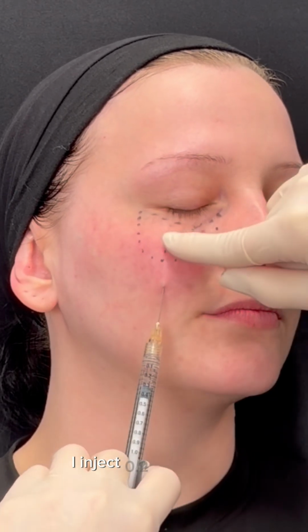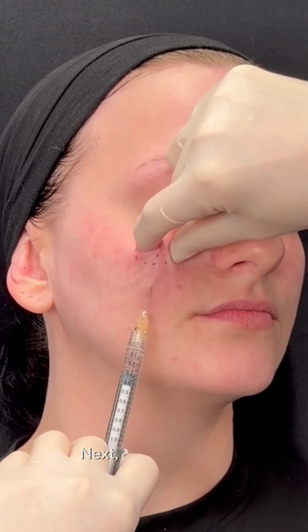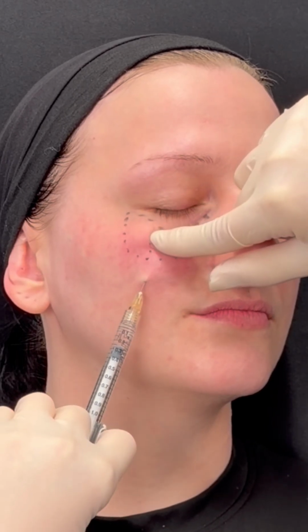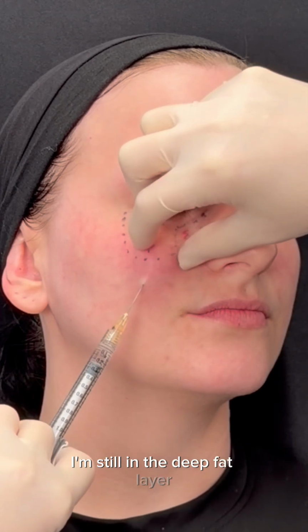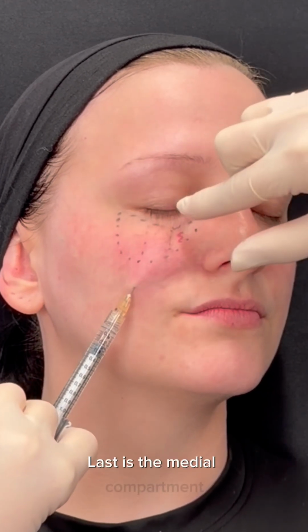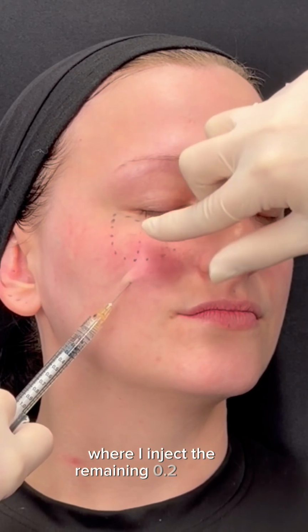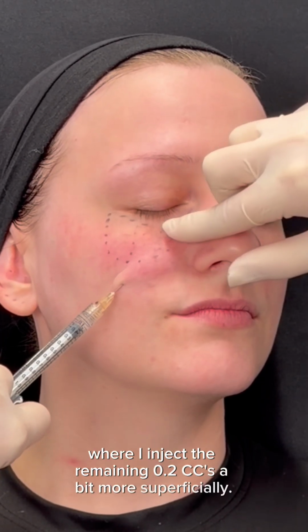I inject 0.2 cc's in the lateral compartment. Next, I inject 0.1 cc into the central compartment. I'm still in the deep fat layer, going very slow. Last is the medial compartment, where I inject the remaining 0.2 cc's a bit more superficially.